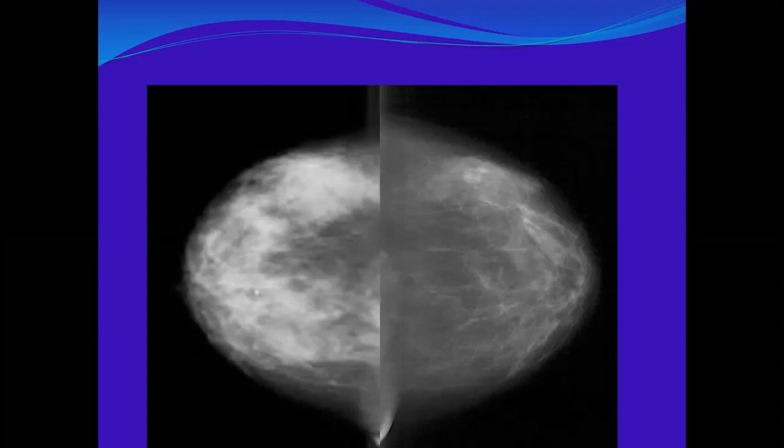You are right, or if I tell you hormonal therapy. If I told you these are microcalcifications, I will think of invasive ductal carcinoma, invasive or other types.